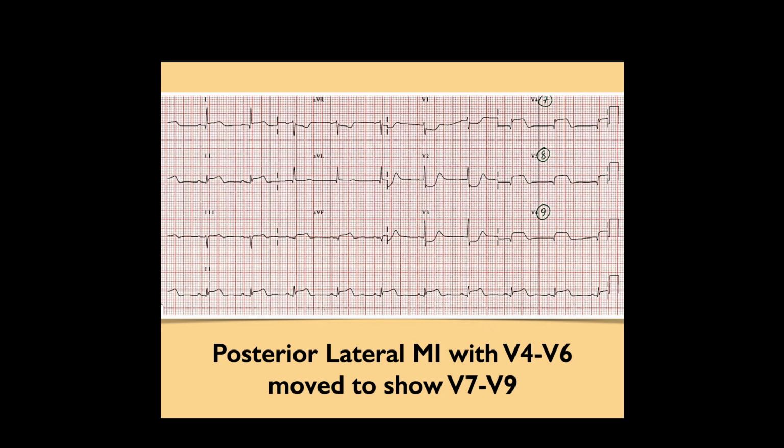Okay, so here we have our inferior, so we definitely have suspicion of a posterior, and they checked, and sure enough, it is a posterior.